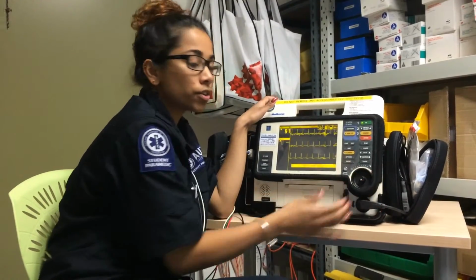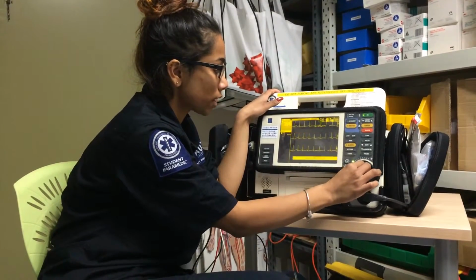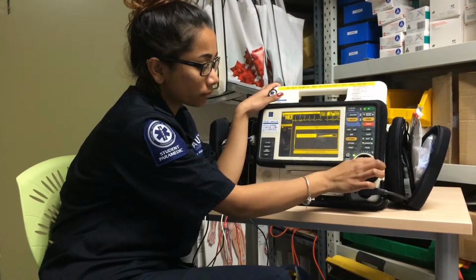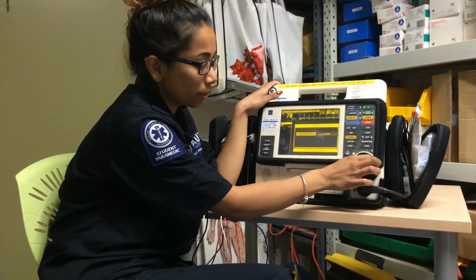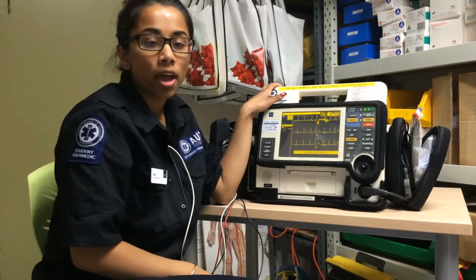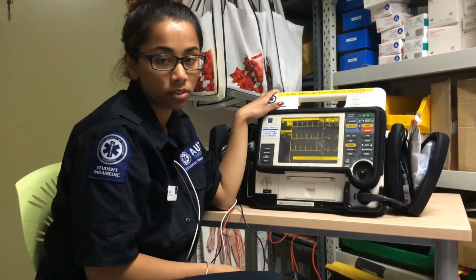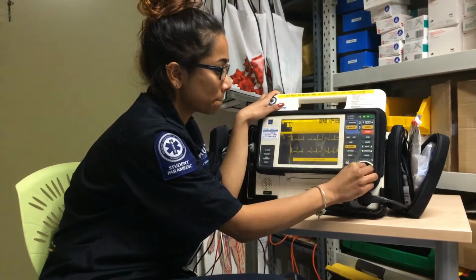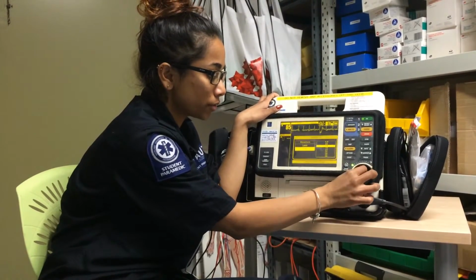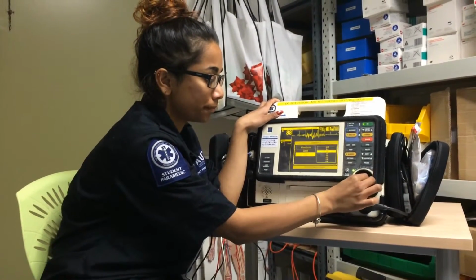So also to adjust the QRS volume, you can go over to the heart rate section, which is located here, and you can either raise the volume or lower the volume, like so. And also, if you want to change the amplitude of the ECG size, you can select the channel, go to size, and you can choose from 1.0 to 4.0, as well as you can also choose 0.25.